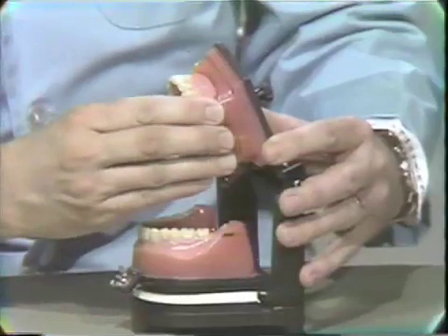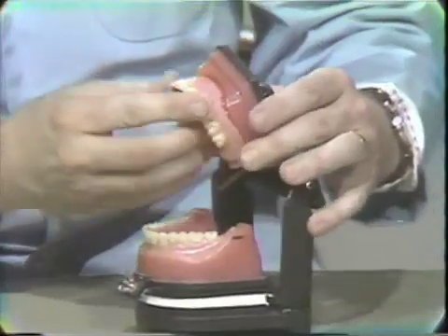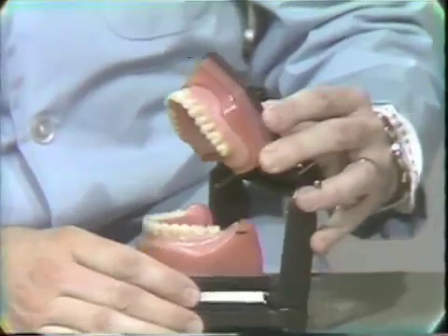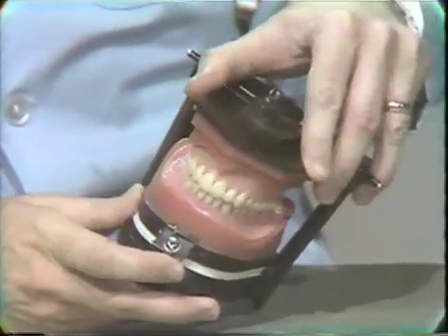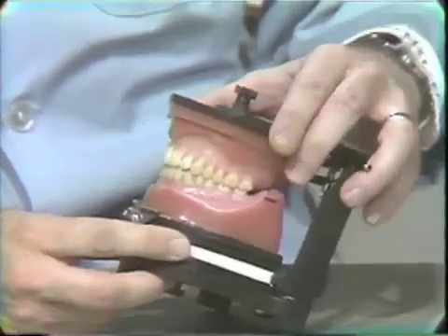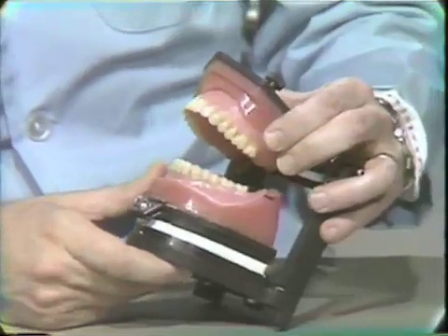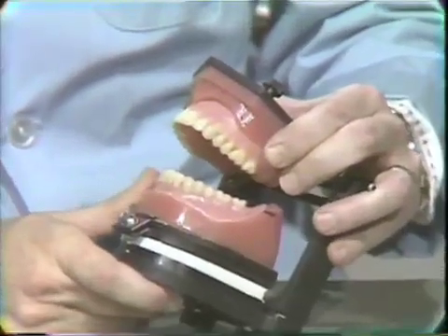By removing only the flash — not necessarily finishing the denture at this time — we go to the patient's mouth, try in the dentures, and adjust the borders and so forth until we are satisfied that the borders and the tissue surfaces of the dentures are satisfactory, but the occlusion probably is not because of the processing changes. So our aim at this appointment is to adjust the occlusion before we let the patient go with the denture.